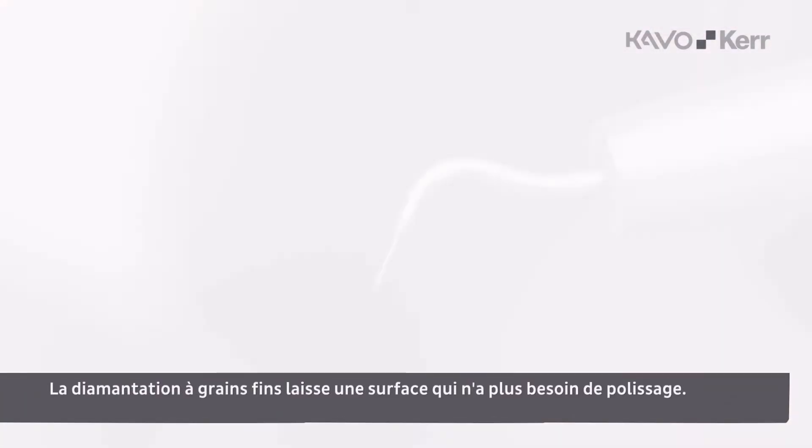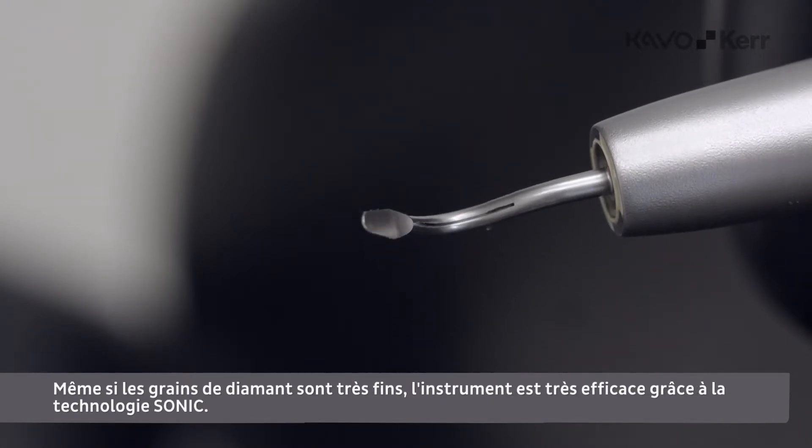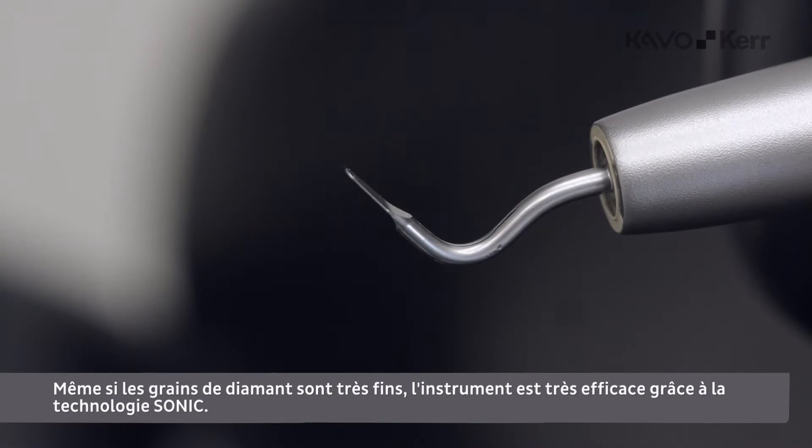The fine diamond coating leaves a surface that doesn't need any polishing. Although it is a fine diamond coating, the instrument is very effective due to the sonic technology.